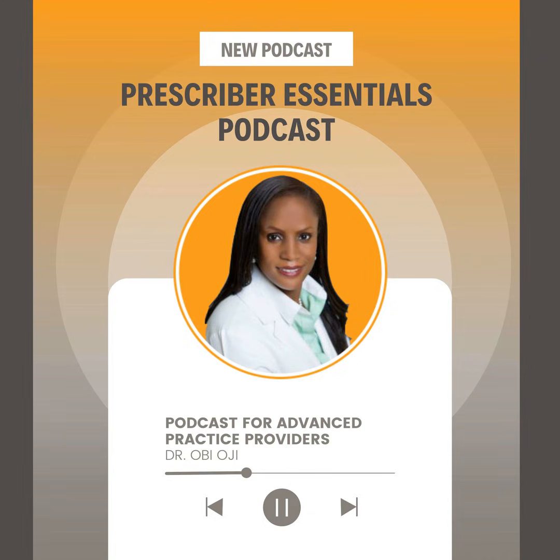And so once you're done with that, then you want to go ahead and squeeze as much as you can, okay? All right, so use your 4x4 and squeeze, squeeze, squeeze. Squeeze that abscess. Get as much out as you can. Okay. All right, and make sure you have a face shield and protect yourself, protect your face.